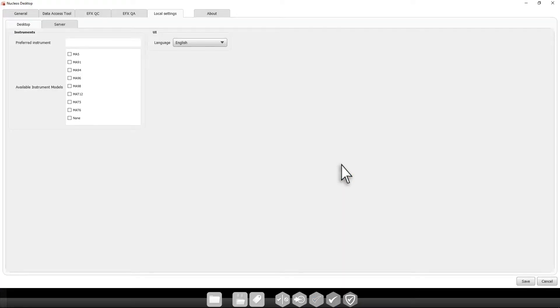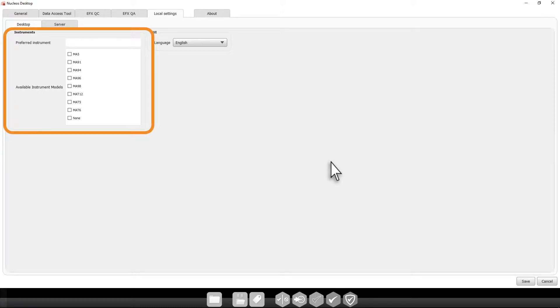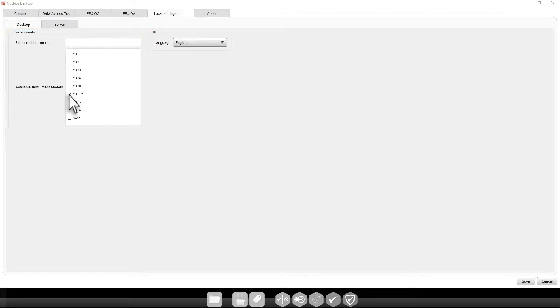The settings window will open. Select the instrument models you will be using. If you do not know all instruments you will be using, that's OK. You can come back to this window later.